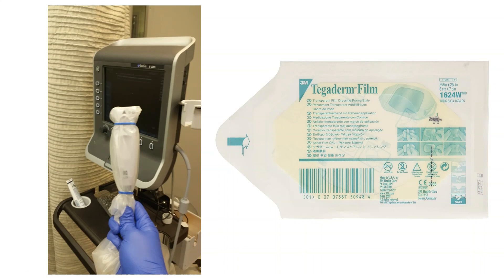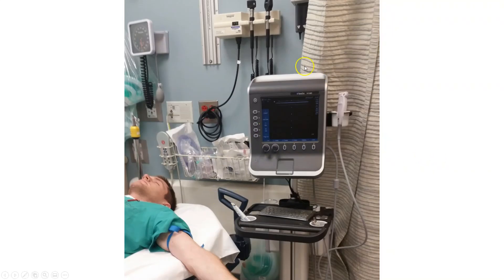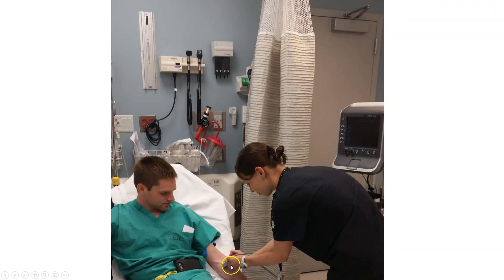Once you've got all your equipment together, the next most important step is patient positioning. The ideal is for your awake, conscious patient to be scooched over in the bed so there's space on the side where you can place the IV. Place the ultrasound machine in a spot that's easily viewable by you. For example, if the machine is right behind the patient, you could sit in front of the arm and look straight up. What's even better is putting it on the other side of the patient for an even better line of sight. An example of bad technique is placing the IV while trying to look at a screen that's nearly behind you — unless you're double jointed in your neck, that's not going to work.